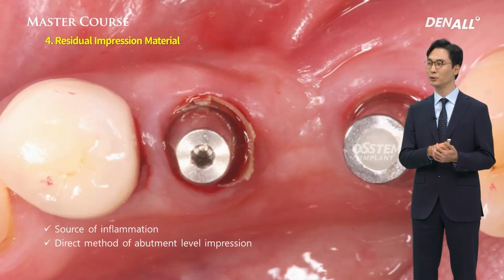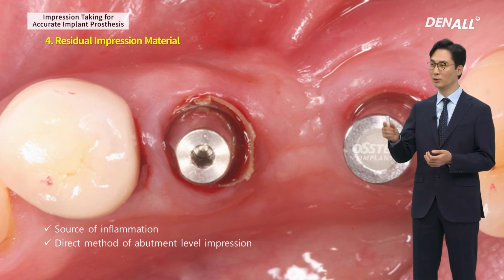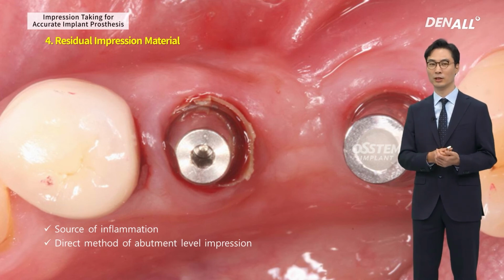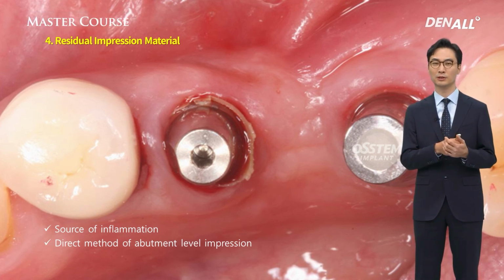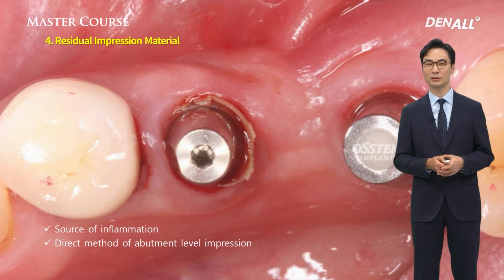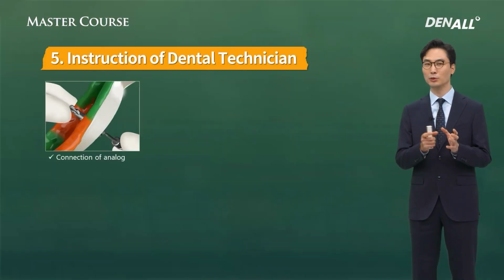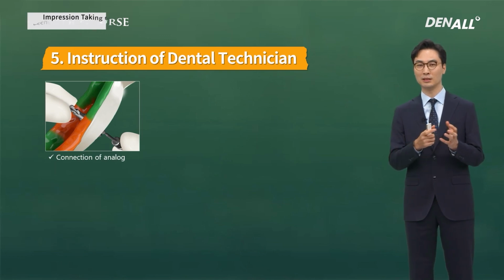When you connect the abutment and take a direct impression after that, more often than not, in the subgingival margin, there's residual impression material, and this could cause inflammation. Especially in the case of abutment level direct impression, after taking the impression, you need to check whether there's residual impression material. This may be minimal, but you need to inform the lab technician or the staff in charge of this.